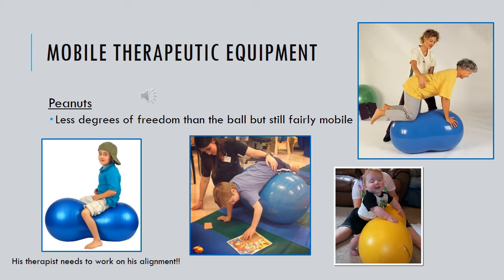You may have a child standing at a peanut to promote some weight bearing, but yet still gives you some external support. So there are a lot of different indications and applications for use of the peanut. The size of the peanut that you would pick would be dictated based on all of the factors we've already discussed: your patient size, the task in which you're working on, and how you envision using the peanut in your session.